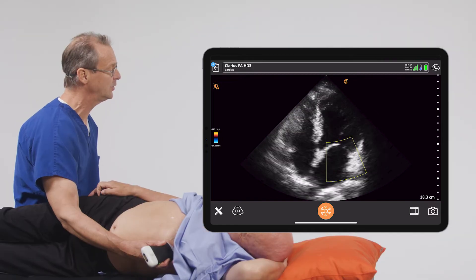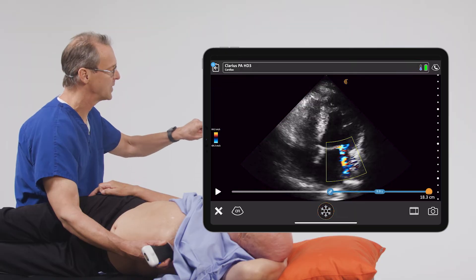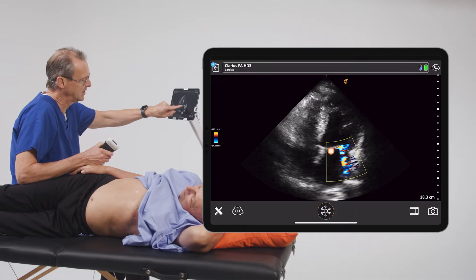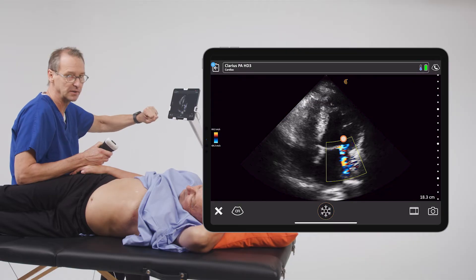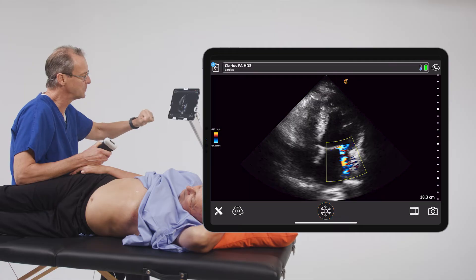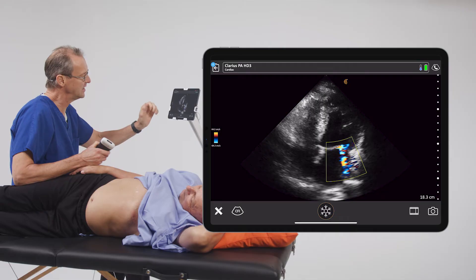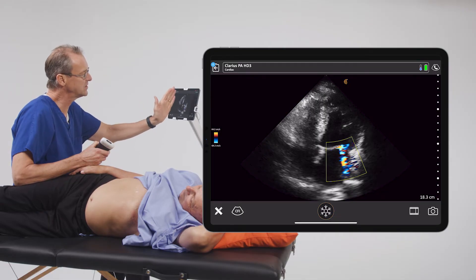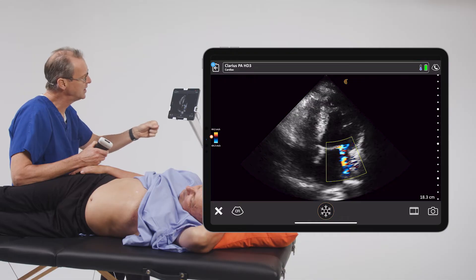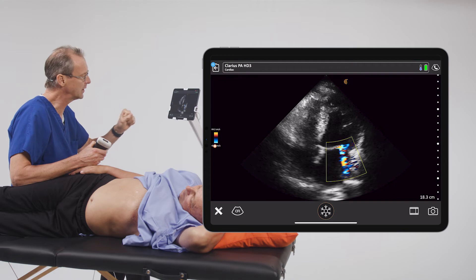To evaluate this patient's mitral regurgitation, we're going to go ahead and freeze the image. When we do so, we can see a mixed picture of red and blue colors in the left atrium. This is an indication of turbulent flow. The way color Doppler works is that if the blood is moving towards the transducer, it is by convention given a red color, and if it is moving away from the transducer, it is by convention given a blue color.